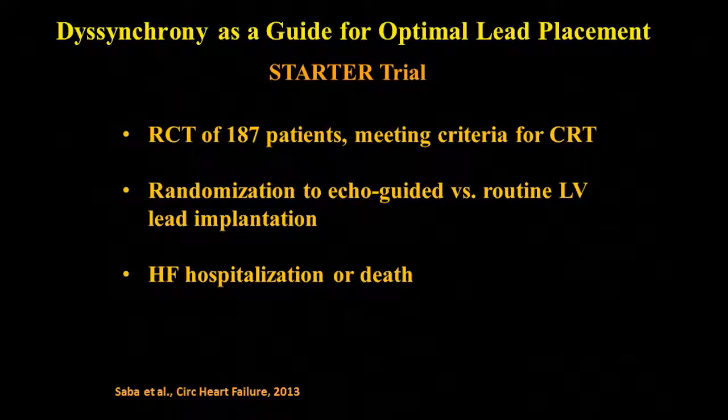Now, how can we use dysynchrony to guide optimal positioning of the left ventricular lead? This was shown in the STARTER trial. This is an echo-based study of 187 patients who were randomized to echo-guided placement of the left ventricular lead, versus empirical placement based on the operator's recommendation of where to implant the LV lead. The endpoint was heart failure hospitalization or death.